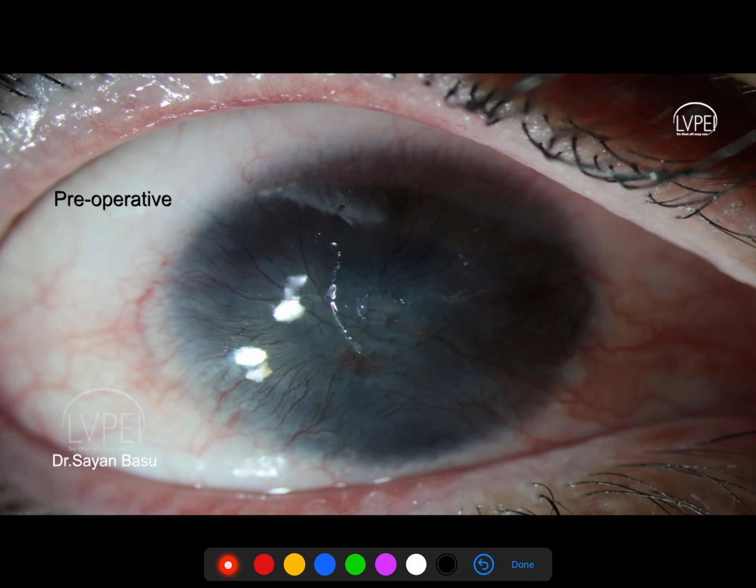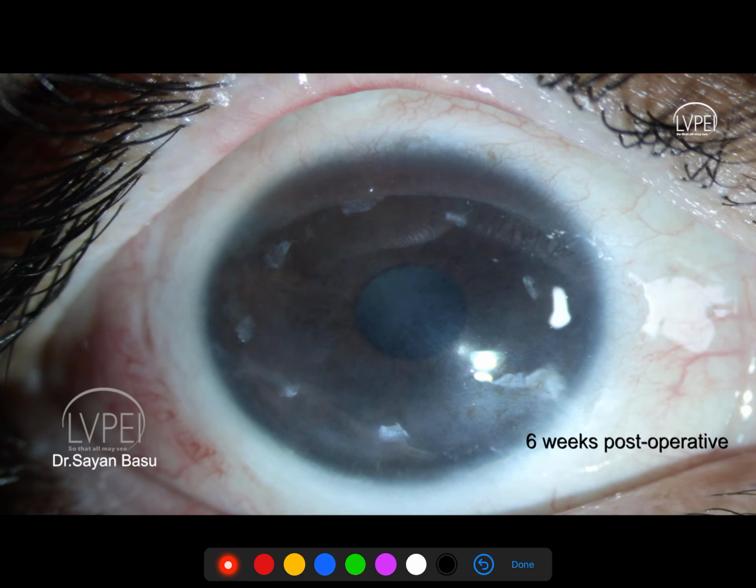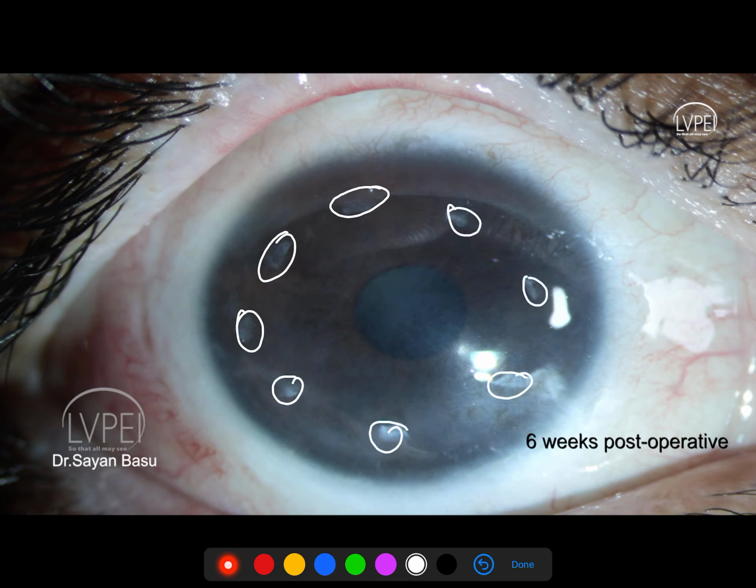And this was the preoperative appearance of the ocular surface when we saw it before surgery. I showed you the photograph and I showed you the surgery, and this is the post-operative appearance after 6 weeks. And you can see how nicely the cornea has cleared up. You can see the individual pieces exactly where we placed them. None of them have moved from their position, they're all there.